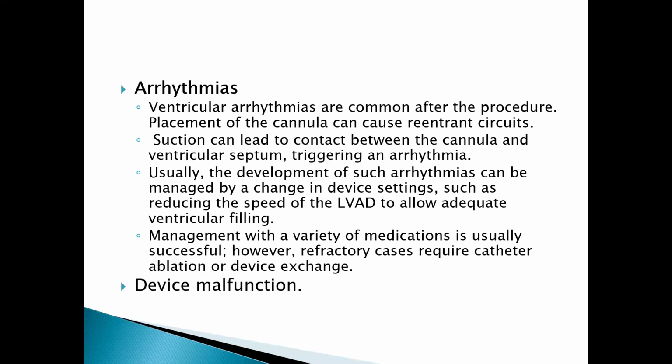And also arrhythmia has been implicated as one of the complications. Ventricular arrhythmias are common after the procedure, and placement of the cannula can cause reentrant circuits. Suction can also lead to contact between the cannula and the ventricular septum, which can also trigger an arrhythmia. Usually such arrhythmias can be managed by a change in the device settings, such as reducing the speed of the left ventricular assist device to allow adequate ventricular filling.